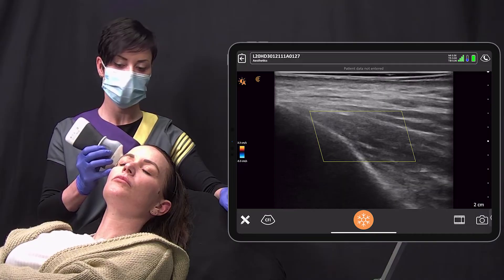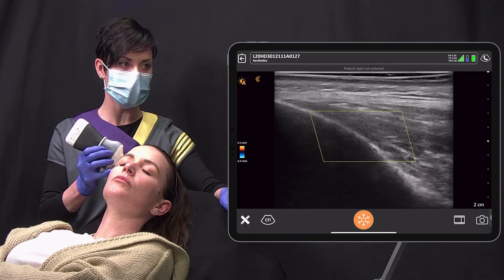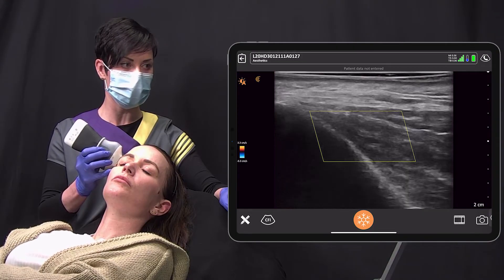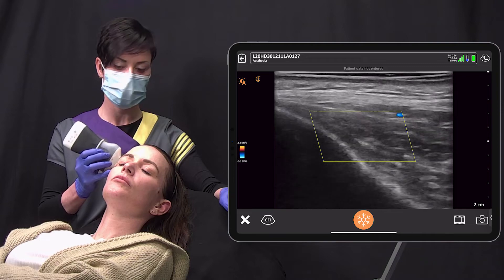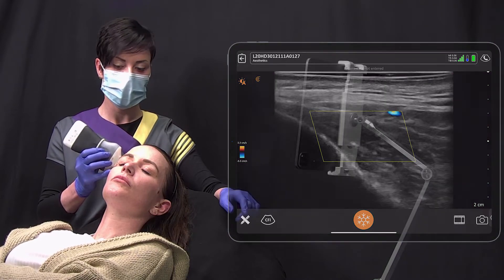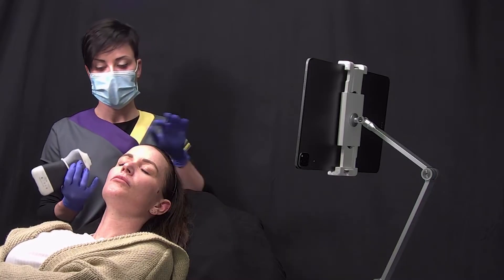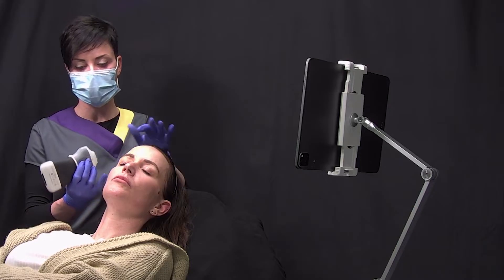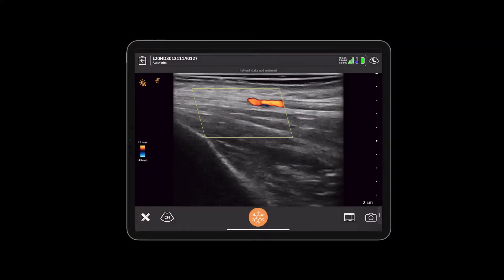The technique many injectors use here is the gunshot, or one-up-one-over, along from the temporal crest. I'm checking in that spot for the deep temporal artery on the bone — I don't find one here, so in theory I could use this technique. Just make sure if you are going to use that technique, you scan both sides of the patient's face preoperatively, as the anatomy can be very different. This patient actually had temple filler with the one-up-one-over technique a couple of years ago, and here you can see the remnants of the filler as hypoechoic deposits, with the filler actually placed in the temporalis muscle.